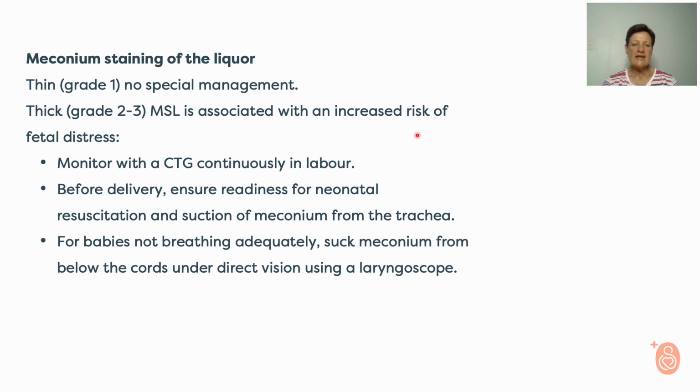We don't know exactly when. It's highly likely that it has been recent if the meconium is still thick. And that's why it's so important to really monitor the fetus very well. My principle is that whenever there's meconium in the liquor, to always start monitoring the fetus continuously with a CTG, so that one can see whether this meconium-stained liquor is associated with fetal distress now or not, or whether the fetal pattern is normal or not.